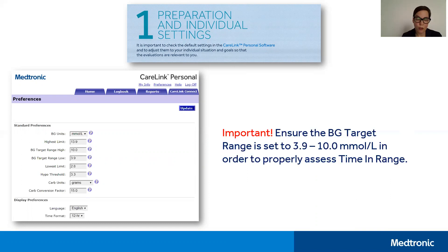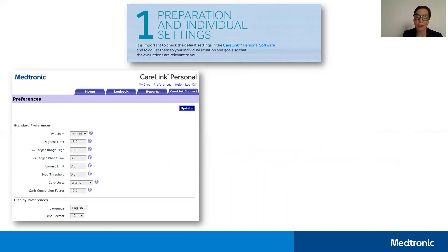One of the things we will all want to ensure is correct is the BG target range. Ensure that it is set to 3.9 to 10 millimoles per liter in order to properly and fairly assess time in range. Once you've completed this, click Update to save all your customized settings.